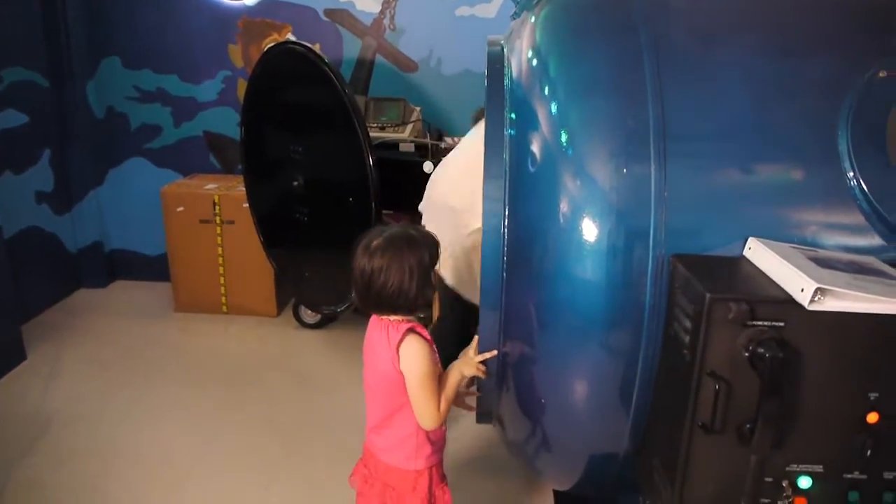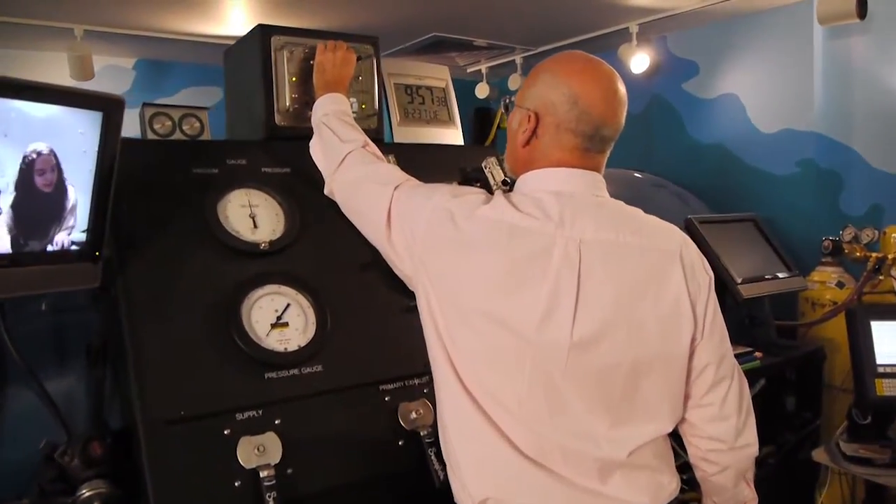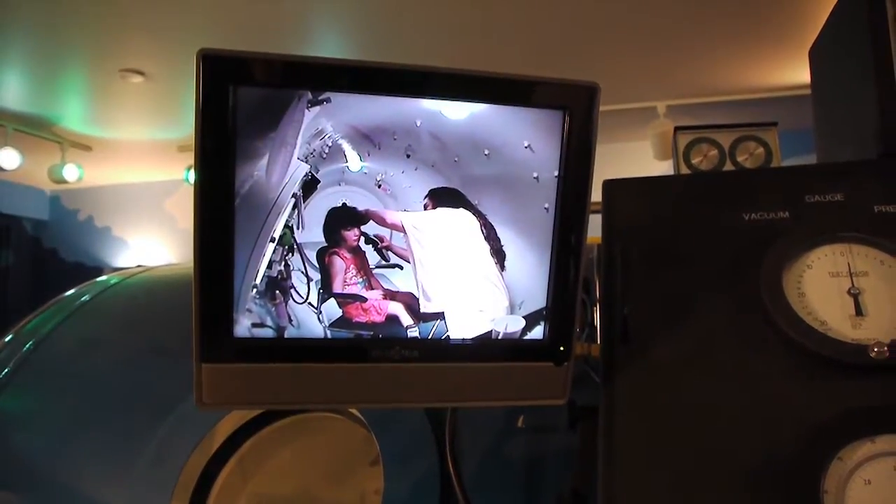What we're seeing today is a pressure chamber. This pressure chamber is like walking into a little submarine — you walk in and the pressure can be altered to mimic going up and down a mountain, or going up the U.S. Steel Building and coming down the elevators.